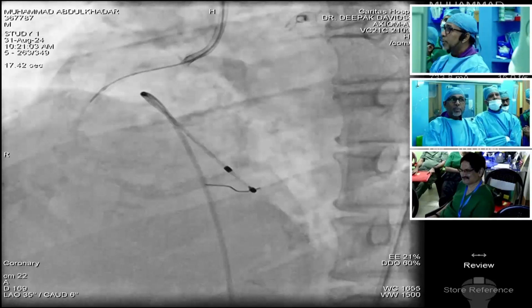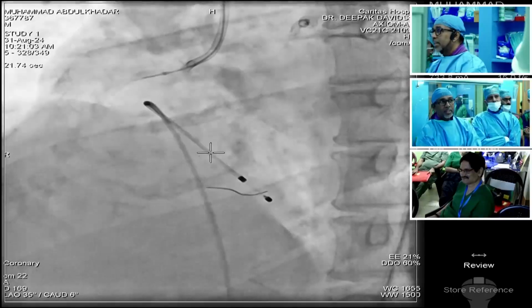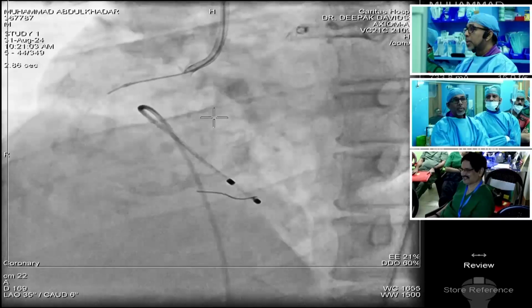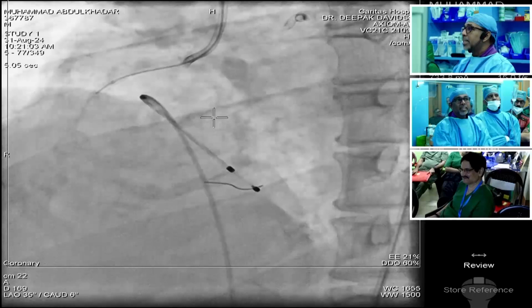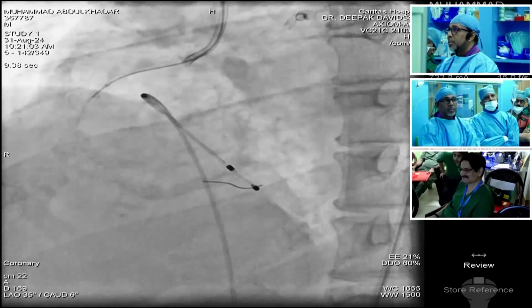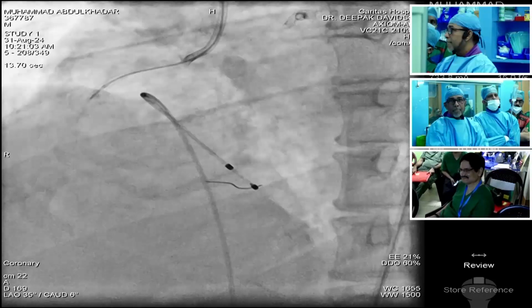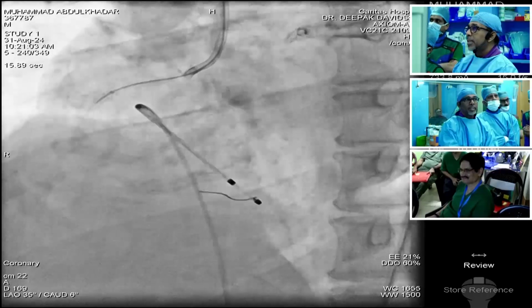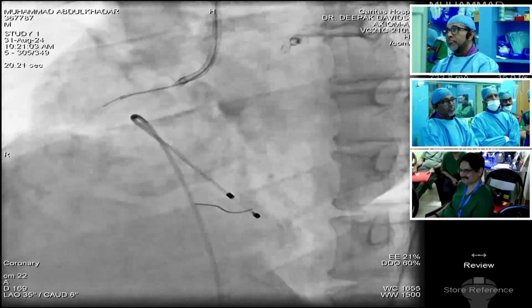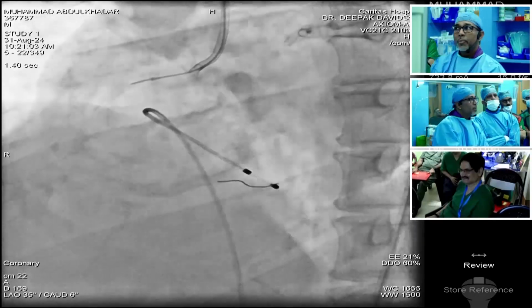Now during the procedure, if we are doing rotablation, if the blood pressure drops during brady and temporary pacemaker, then we would always give atropine. We would want to have an atrial kick also. But here the blood pressure is 160 even when it's pacing. So we haven't given atropine. So now we have waited almost for 2 minutes. Shall we give one ampule of atropine?